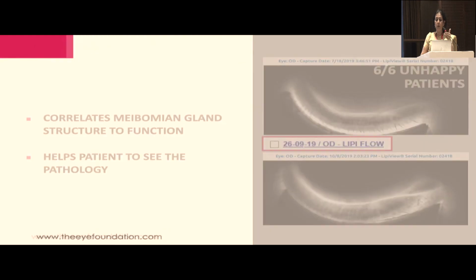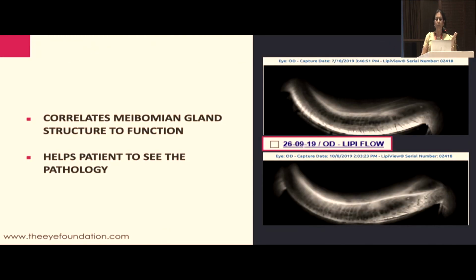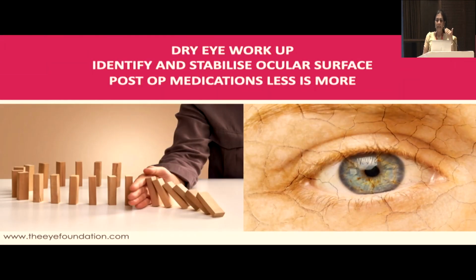And you could even do a meibography sometimes to explain to the patient, look at your meibomian gland dropouts, and that helps the patient to understand, and he is with you all through rather than you losing the patient to some other person.